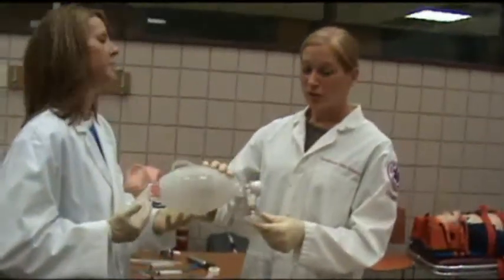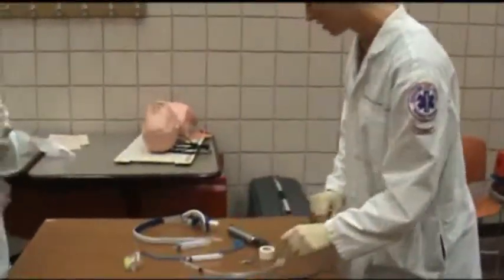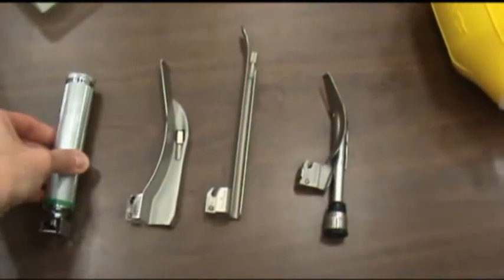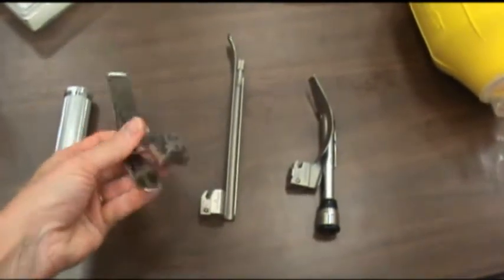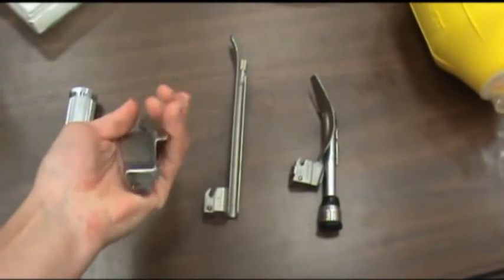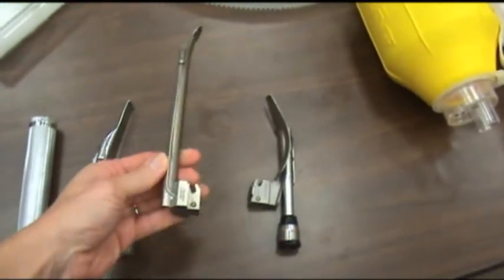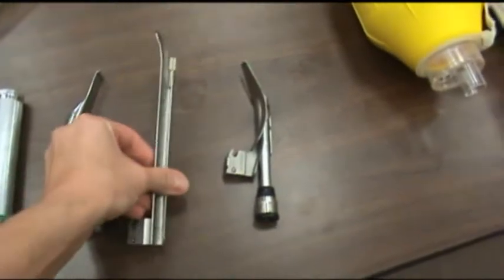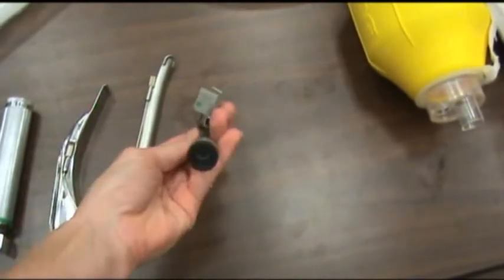This is the bag valve mask we'll be using today — it is used for ventilation. Over here is our intubation equipment. You have the laryngoscope with the light; this is the laryngoscope handle, which holds the batteries and connects to the laryngoscope blade. There are several different kinds of laryngoscopes. This one is a Macintosh number three. This one is a Miller number three, which is the blade used for this video presentation. This last one is a blade with a magnifying lens to view your landmarks.